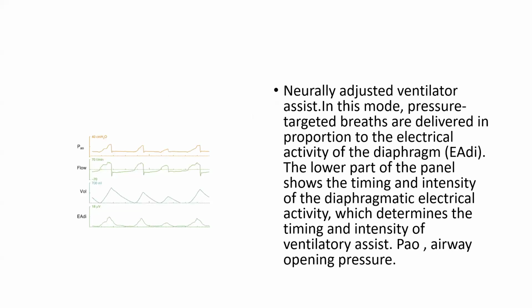So this is the waveform of NAVA. In this mode, pressure targeted breaths are delivered in proportion to the electrical activity of the diaphragm. The lower part of the panel shows the timing and intensity of diaphragmatic electrical activity, which determines the timing and intensity of the ventilatory assistance.